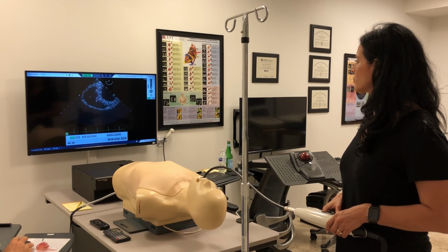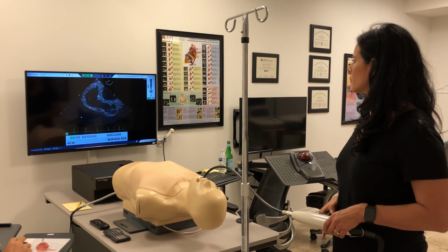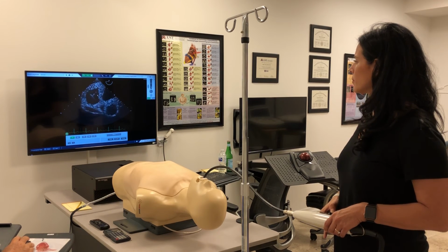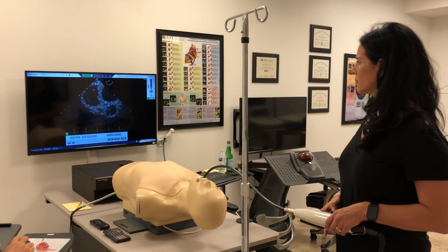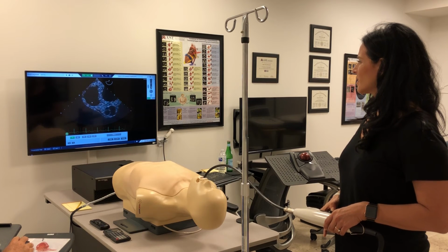Now, you're seeing the chordae and maybe the tips of the papillary muscles of the tricuspid valve, but we want to anteflex our way up towards the base of the heart. Good. A little bit more. Now we're in the chordae, now we're in the tips of the tricuspid leaflet. They're coapting. And this nicely illustrates the septal leaflet attached to the septum. Inferiorly, here next to the probe, that's called the posterior leaflet. And then right across from it, of course, is the anterior leaflet. It's the biggest of the three leaflets.